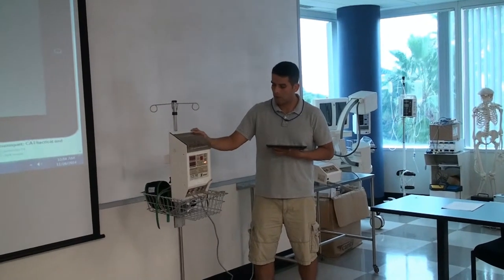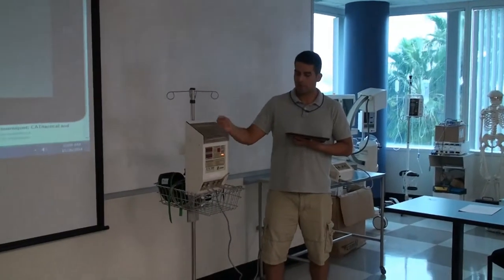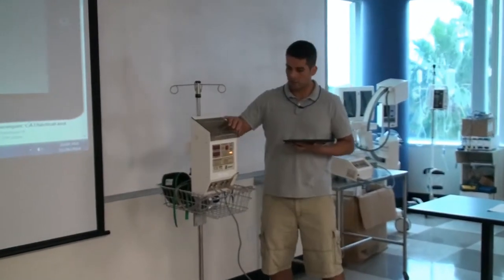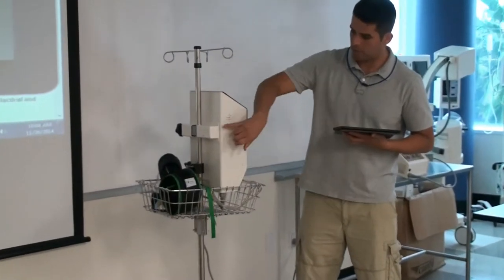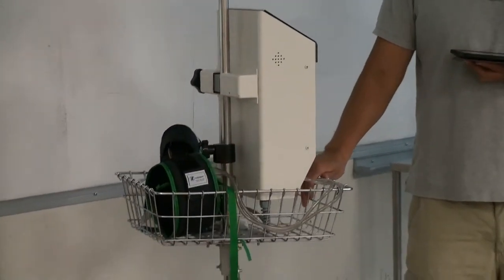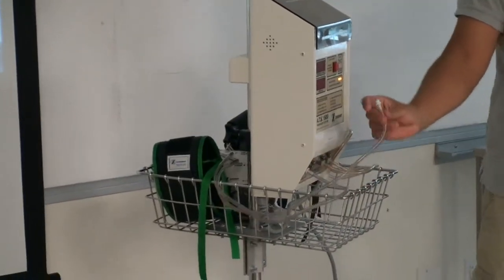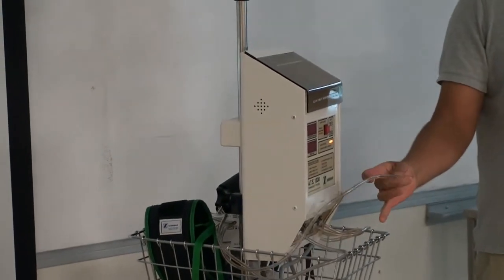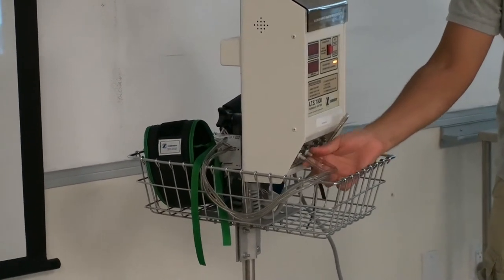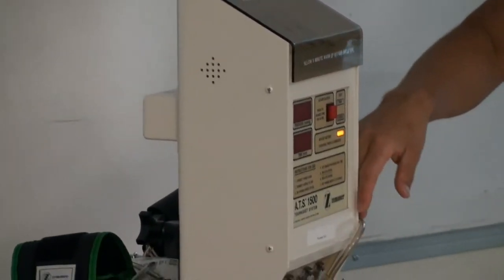Physical inspection. Every 6 months, the manufacturer recommends a physical inspection. On the exterior and the interior, there should be no rust and it should be clean of dust, especially because these holes are the ventilation of the unit to avoid overheating. Check the condition of the connectors where the cuffs are connected through the tubings. Check the condition of the tubings, no cracks, no dryness, so it can guarantee accuracy in the unit.